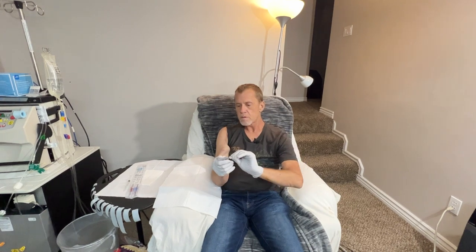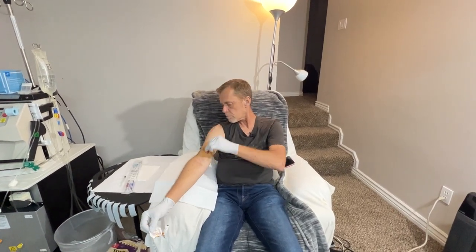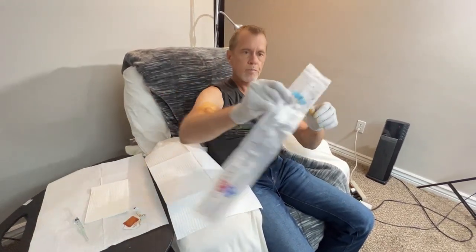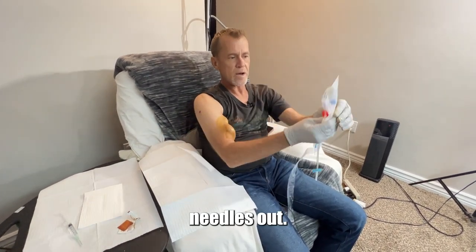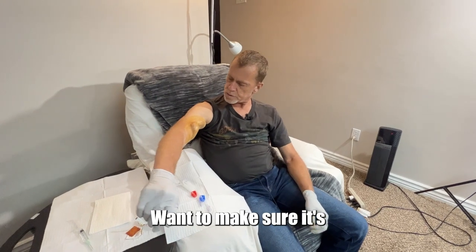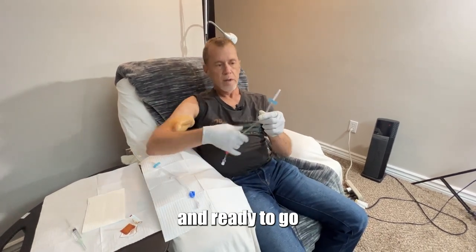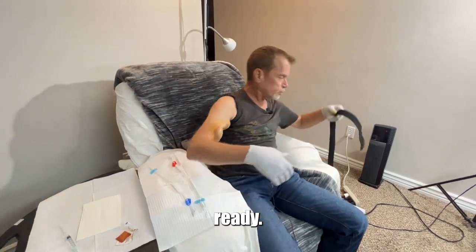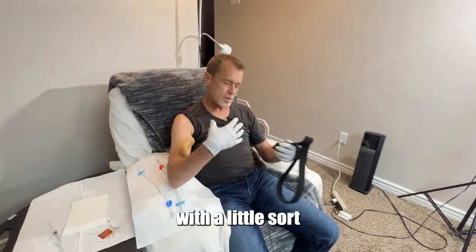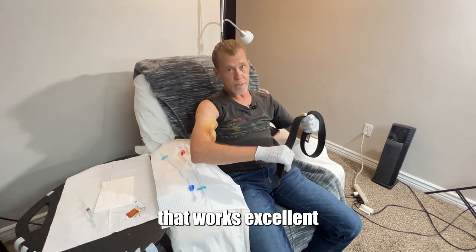I'm going to sterilize it now with betadine. Needles out. Now we give it just a minute for the betadine to dry — we want to make sure it's dried and sterilized. In the meantime, we'll get our needle out and ready to go and also get our tourniquet ready. Now there are medical tourniquets they give you — clamps with a little rubber band — but I've found this nifty little belt. It doesn't have any holes and it's a stretchy material. It works excellent as a tourniquet.